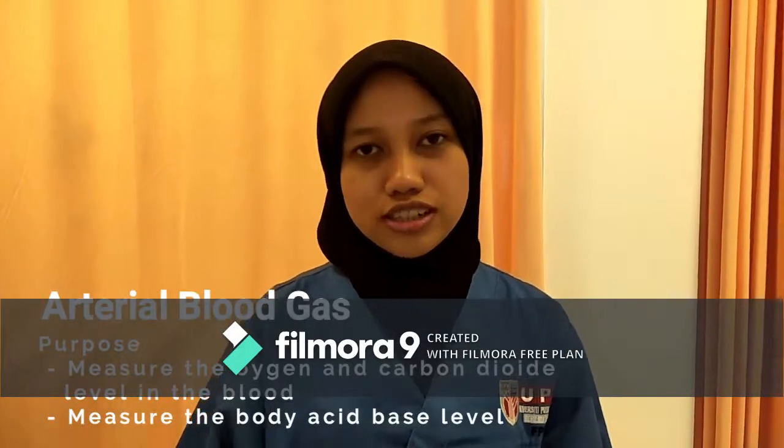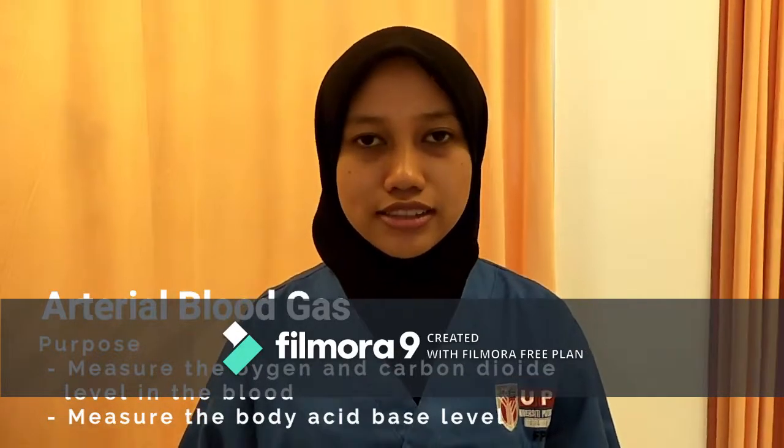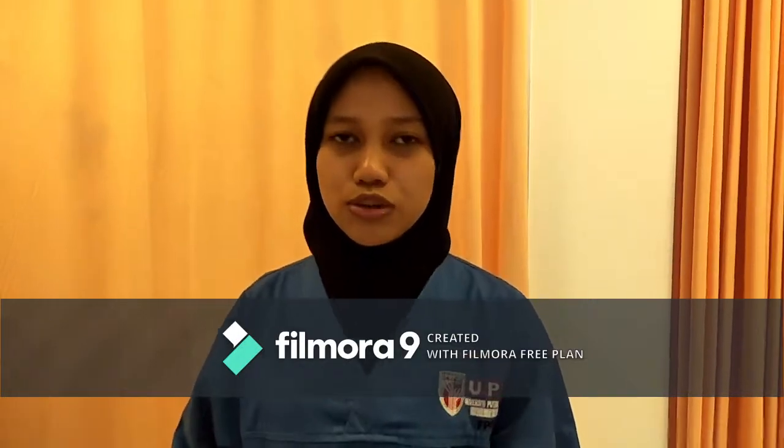So the purpose of arterial blood gas test is to measure the oxygen and carbon dioxide level in the blood. It also measures the body's acid-base level, which is normally balanced when healthy. So Nadira will show us how to perform the ABG test procedure.